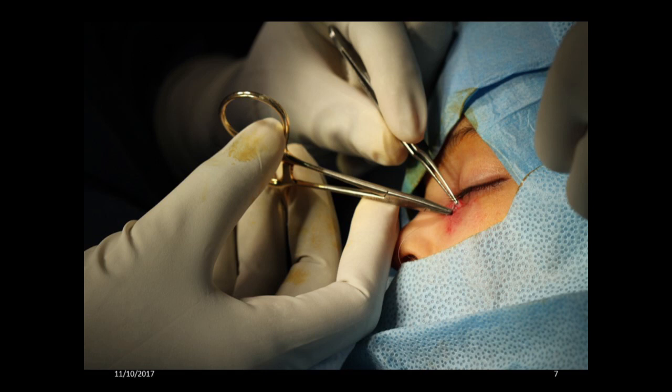This child had sustained an injury over his face close to his eye. This could be one of the best examples for the control required while maneuvering the needle over the face. You can see the index finger of the suturing hand is supporting on the patient's nose. This type of support eliminates unwanted and risky movements of the needle and needle holder tip around the eye. The result will be the best possible control over the suturing process and safety of the tissues being sutured, as well as the important structures around the wound.